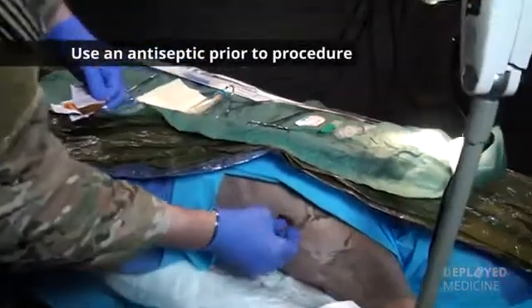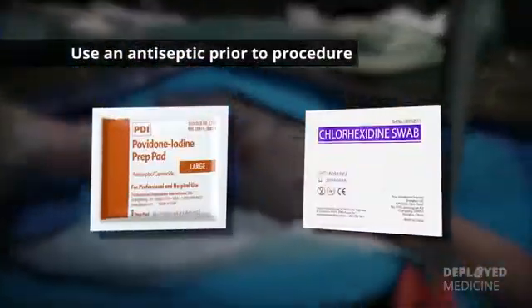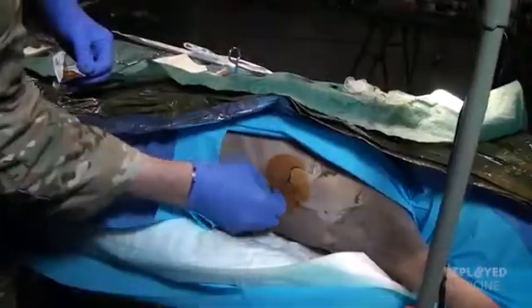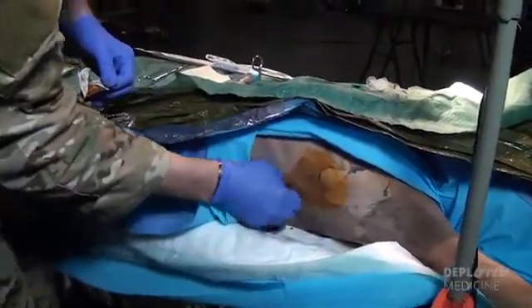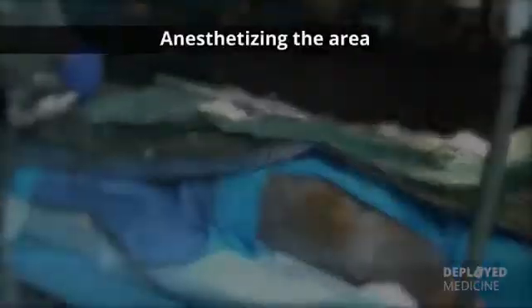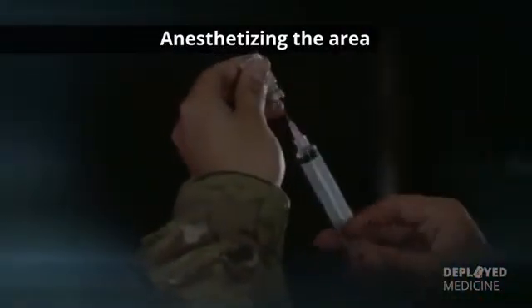Ensure that you use some sort of antiseptic, whether that be iodine, chlorhexidine, whatever it may be. Just make sure you use something that is a good antiseptic because you are going to be entering into the chest here. Okay, our next step in this procedure is to go ahead and anesthetize the area.